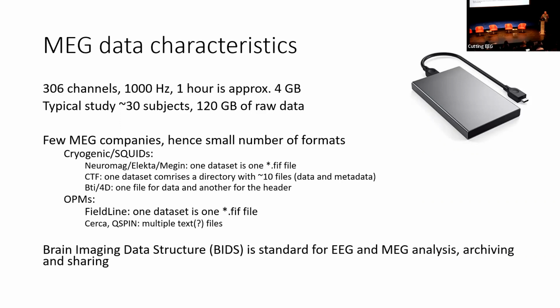Yesterday, Joanna already mentioned BIDS, the Brain Imaging Data Structure. I think that's going to be a more and more important strategy for us to organize our MEG and EEG data for archiving within the lab, but also for sharing between labs and hopefully also for public sharing.